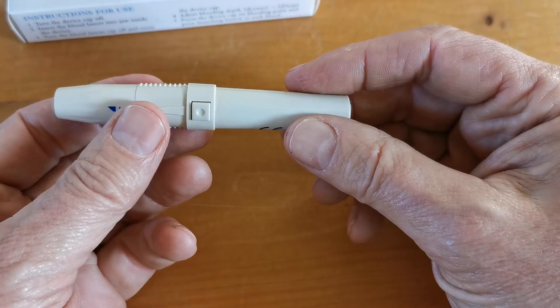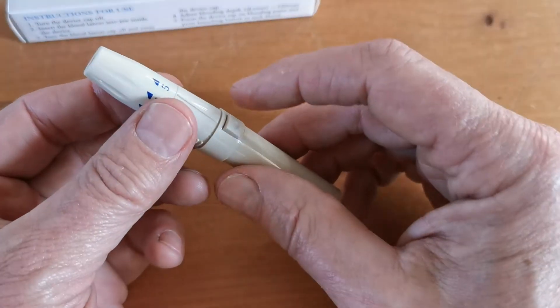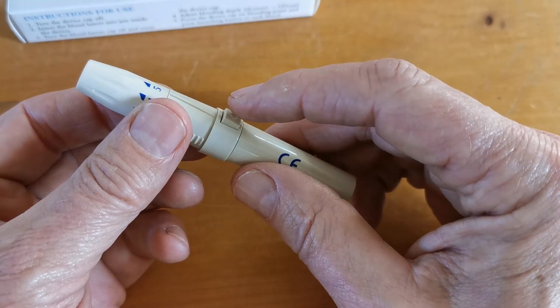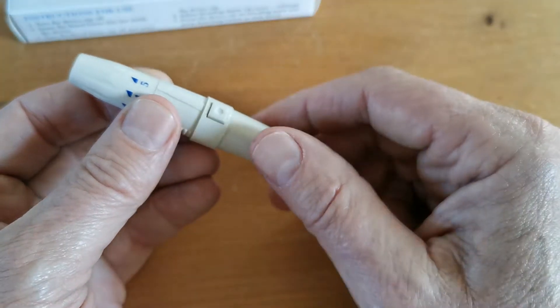To prime this spring-loaded lancing device, you simply pull the barrel and release — now that is ready to go. The releasing mechanism is this trigger here. If I just trigger it, you'll hear the spring go. That's fired.